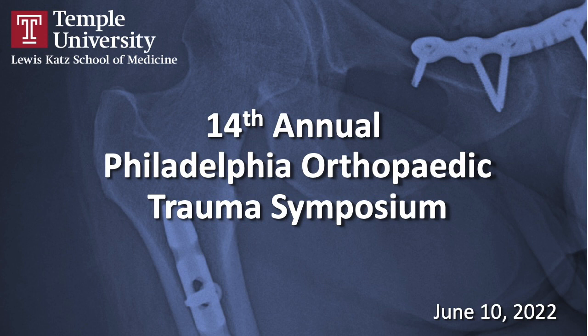My comment is that one of the things in my practice that's made a big difference for definitive external fixation is the use of HA-coated pins. It's dramatically reduced pin loosening and pin infections, and so I'm just throwing that out there. Either unilateral or particularly ring fixation, it is the use of HA-coated pins.